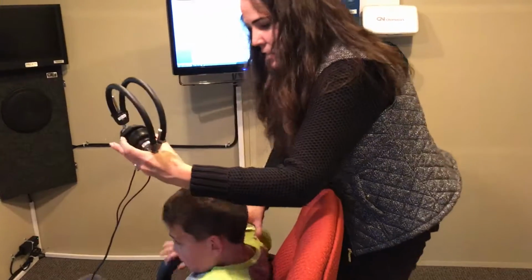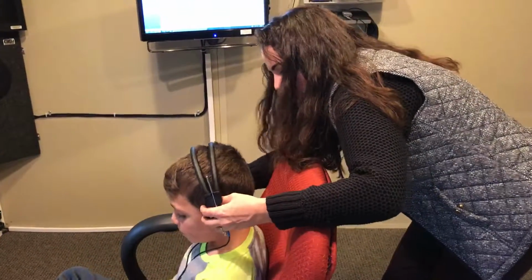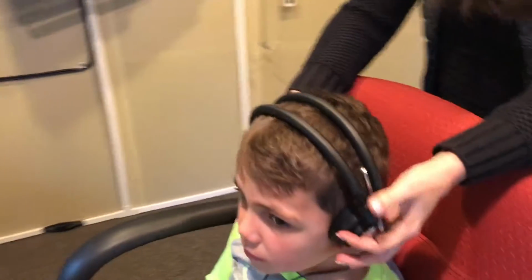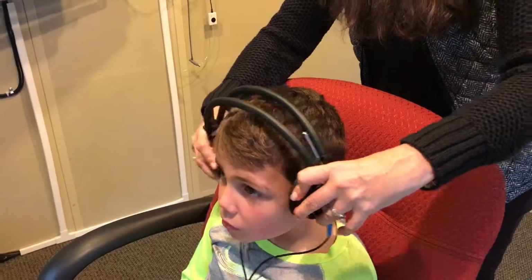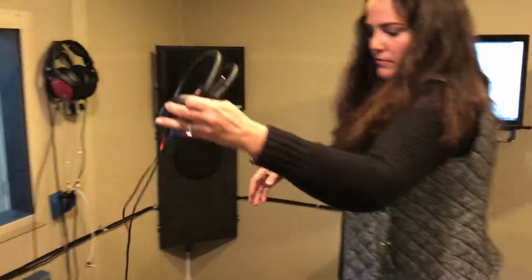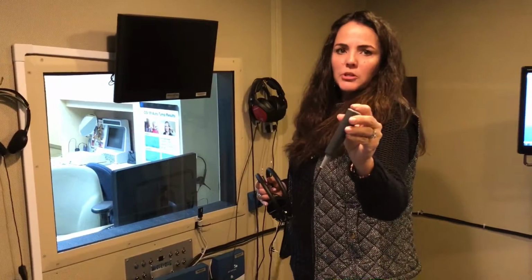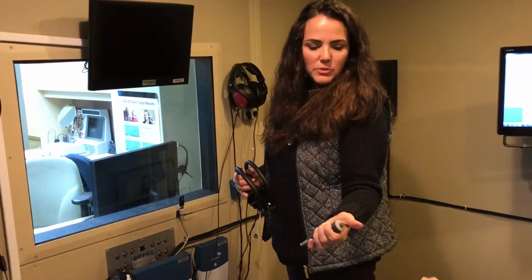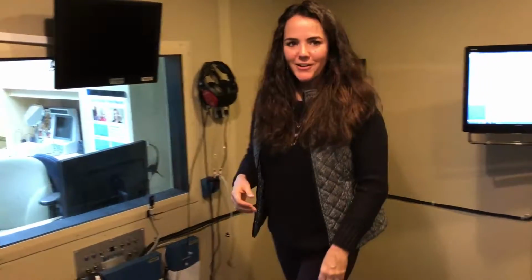When you put the headphones on, you want to make sure they're properly positioned over the patient's ear and tightened there. For older patients, if they're mature enough, they can respond instead of raising their hand by pushing a button when they hear the beep. This is the response switch. And that's the tour of the audiology booth.